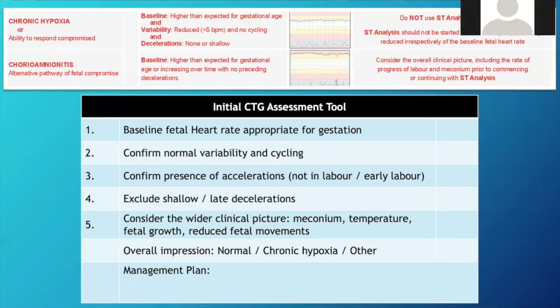That's true, but recently I've been finding in the assessment unit that a few patients haven't had any subsequent clinical FHR recording. Initially they haven't done it in early stages, and even if she had subsequent scans at every visit, for some reason they have not listened to the FHR, they've just written scanned. So when she's coming in to DAU, that is the first time you're recording, and she's 37, 38 weeks and you don't really have a comparison to make.